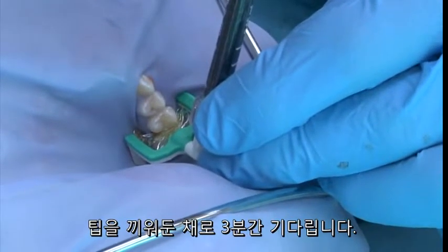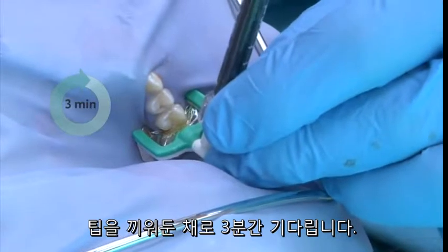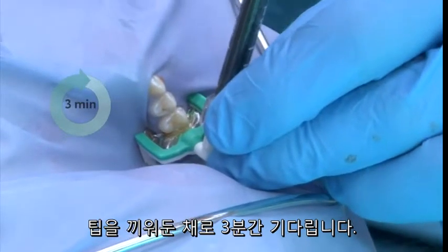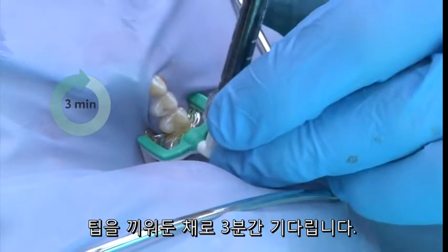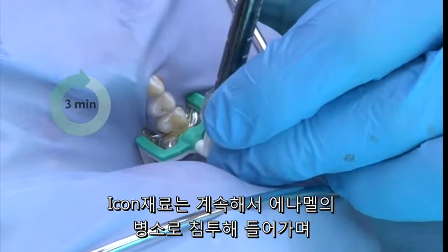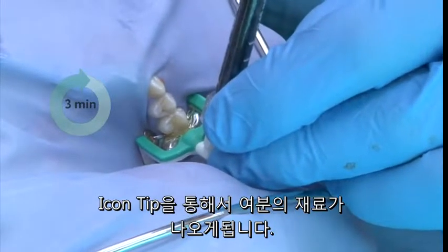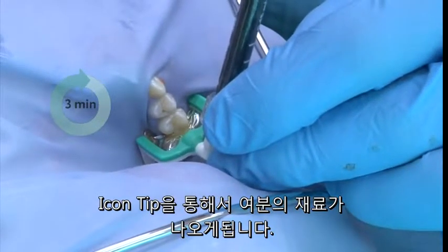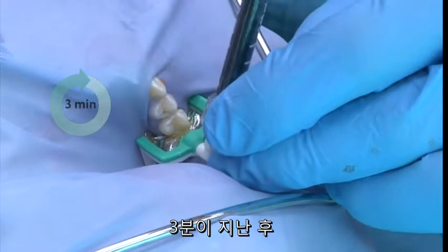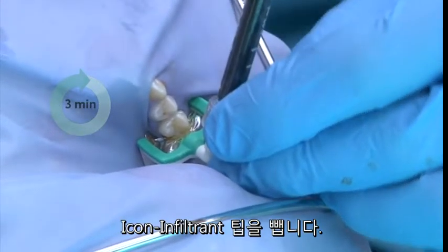Then turn the syringe handle approximately one and a half turns to extrude the resin, and leave the proximal tip in place. The material will continue to absorb into the lesion while additional material is extruded from the Icon syringe by periodic slight turns of the handle.